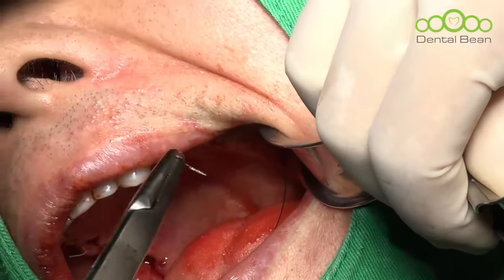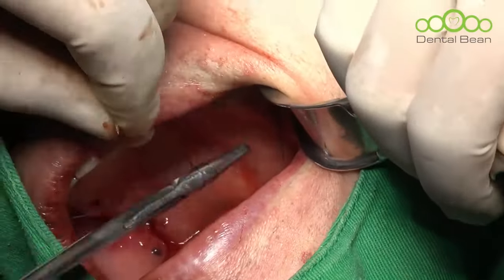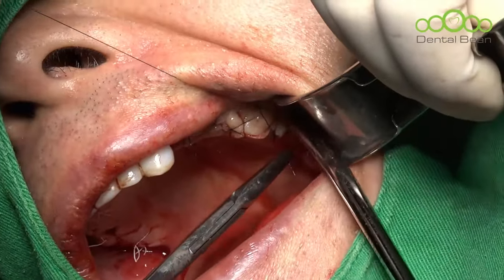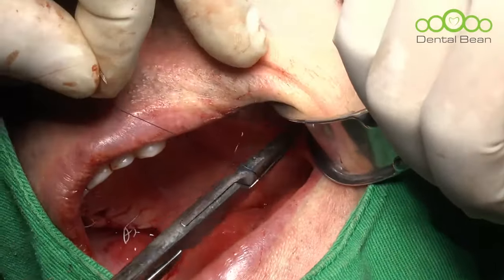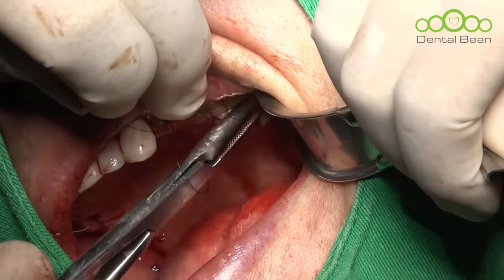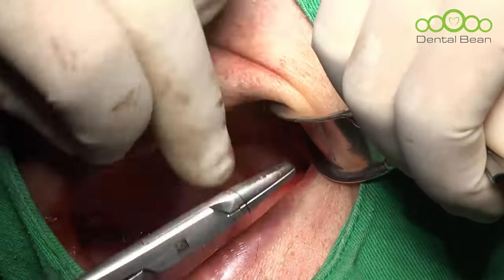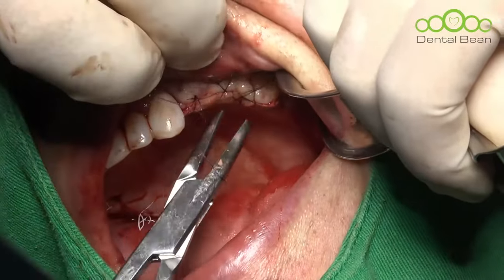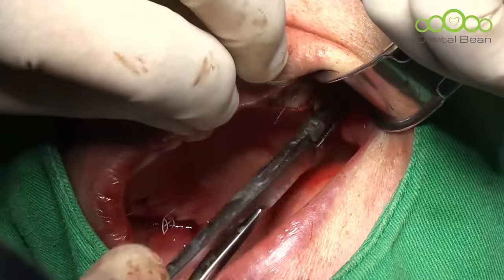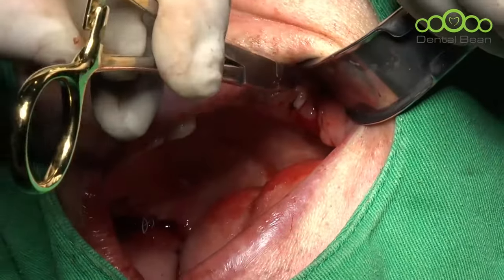Okay, during the window opening, I used the carbide burr, round burr, and half speed. It is low speed handpiece, but the speed must be very high. Better to use maximum speed on your chair. I used the 40,000 RPM in this case. It should be more than 20,000. It should be high speed RPM. If it is slow, we cannot control. So better to use maximum speed.